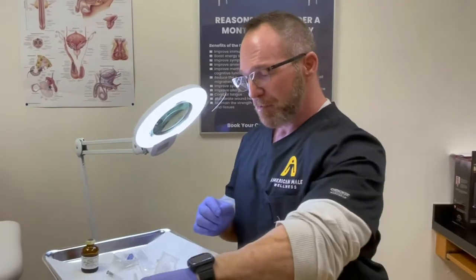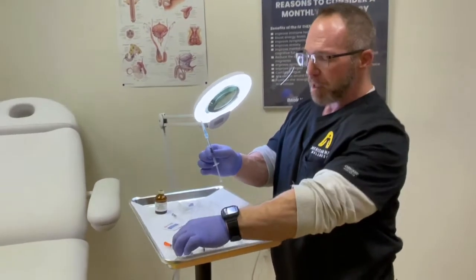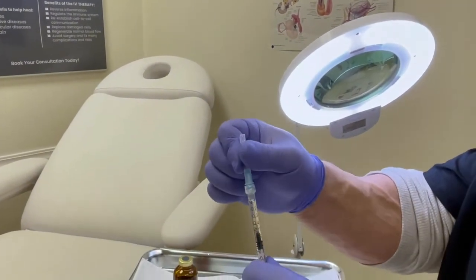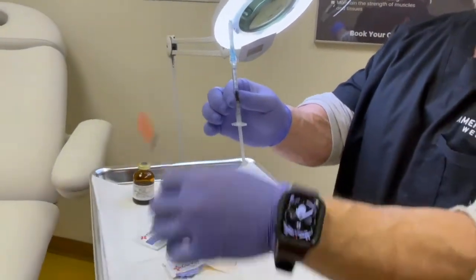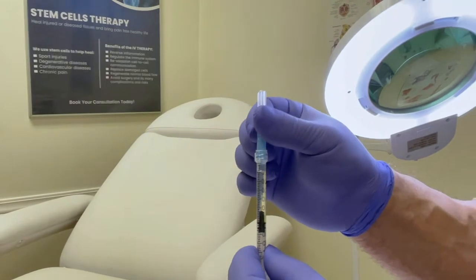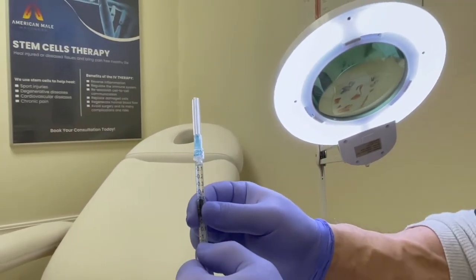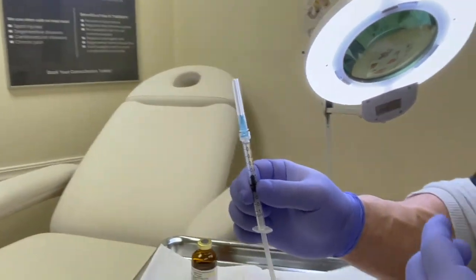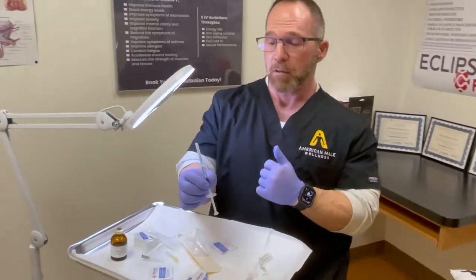Instead, use a luer lock syringe — these come in 1ml sizes just like an insulin syringe and are measured the same way. The difference is the needle detaches, so you can use a finer gauge needle for injection and comfort. You can do 0.1ml, 0.2ml, or 0.5ml doses with the same accuracy, and safely do multiple injections per week to keep your blood serum levels balanced throughout the week.